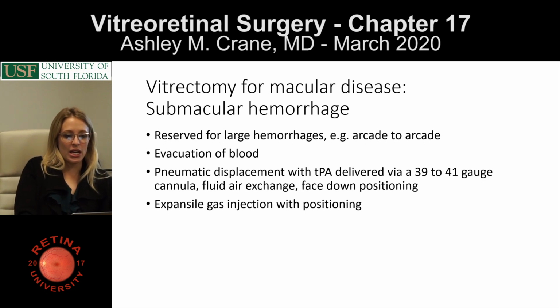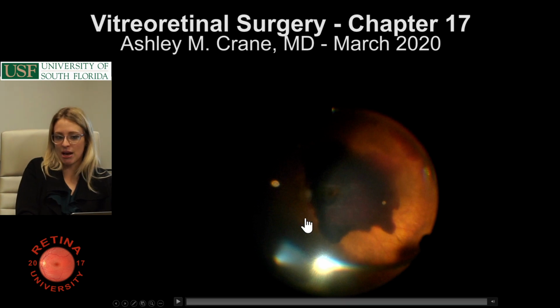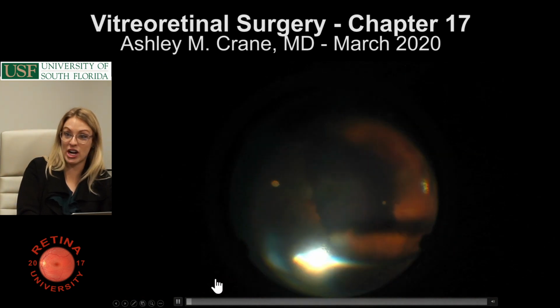You could do an evacuation of the blood, which is very difficult, but pneumatic displacement with TPA is probably the more common option, I imagine. And sometimes there's positioning and tamponade. But I'll show you, I think this is the first one I did because I have not done very many of them because it's just not very common.